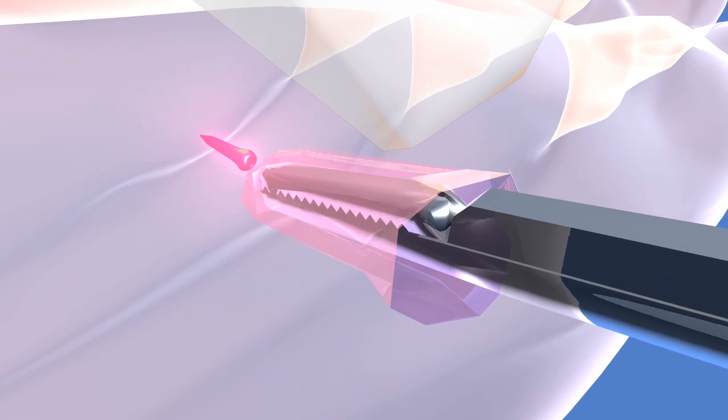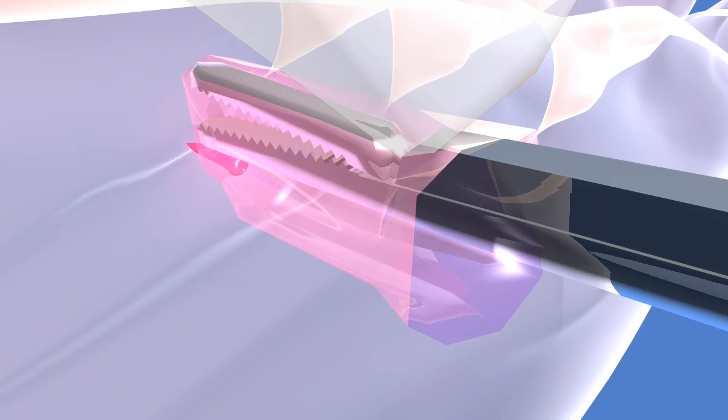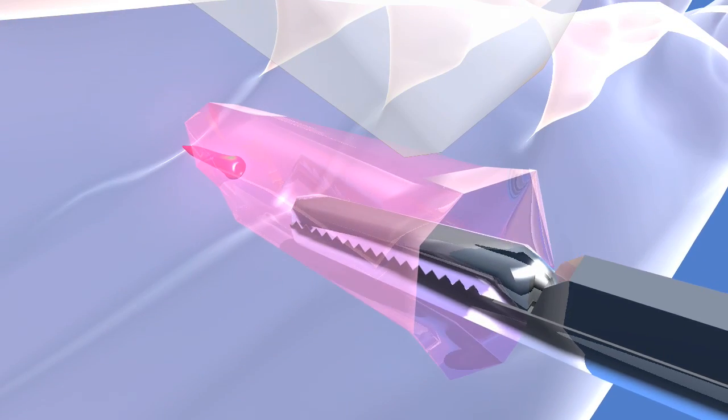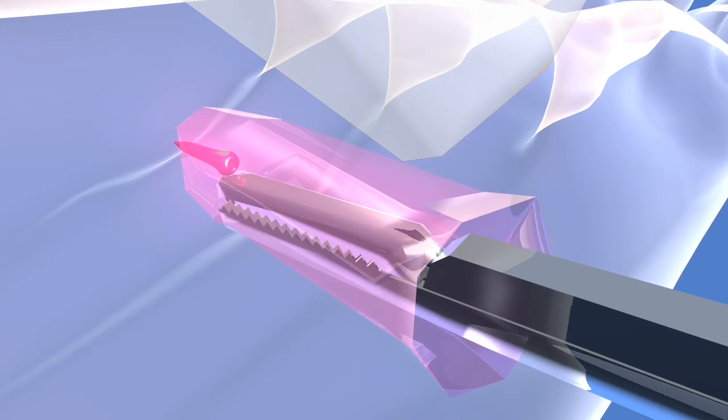Blunt tip forceps are introduced and with blunt dissection a pocket is formed, with the forceps entering the subcutaneous pocket with blunt dissection above and below the foreign body.